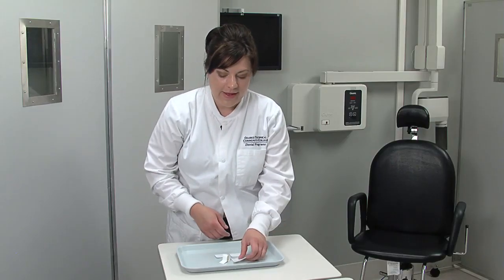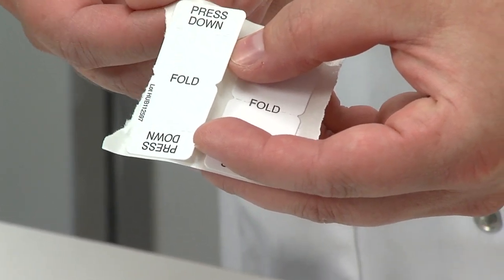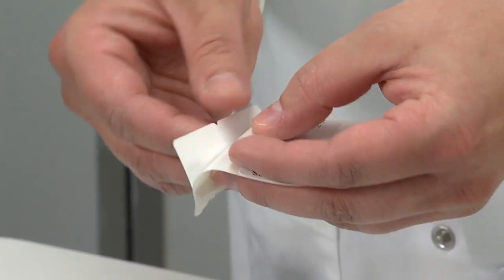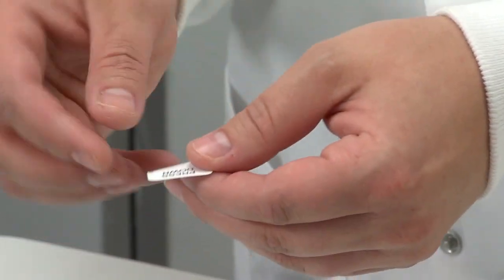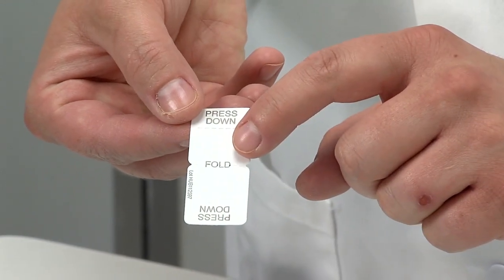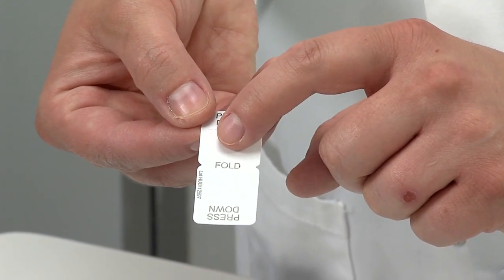The bite wing tab is a self-adhesive tab that comes on a piece of paper that you rip off. After removing the tab, you'll see that one side is adhesive, just like a sticker. You're going to fold the tab in half right here where it says fold.